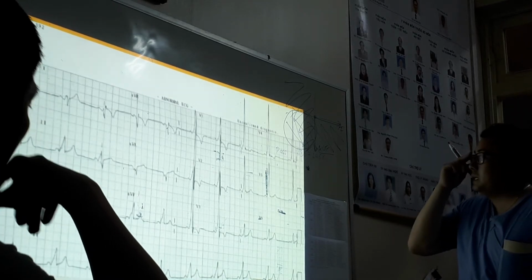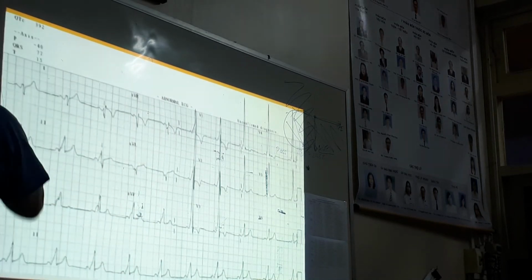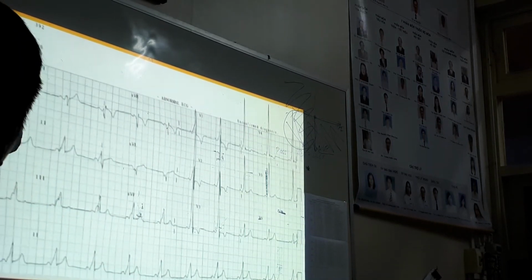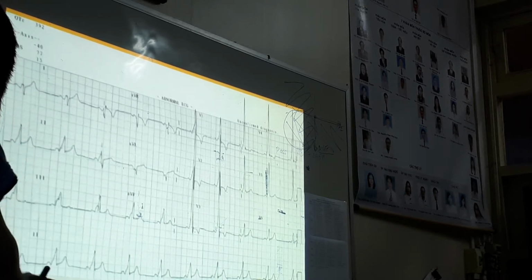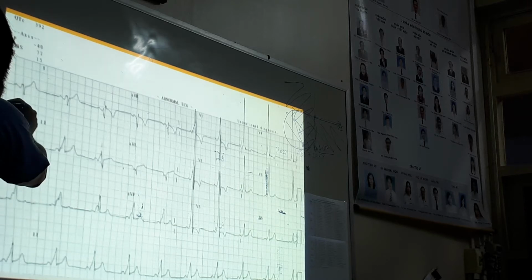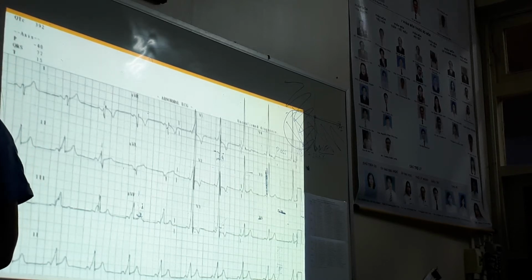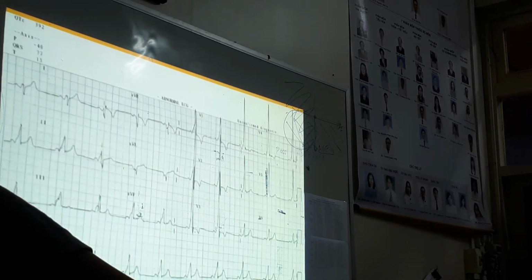But the reason that you have the delta wave here, you have the heart here. Okay, you have SA node going to AV node. Normally, you have your impulse coming here and then going up here, right? But the AV node slows down impulses, okay?